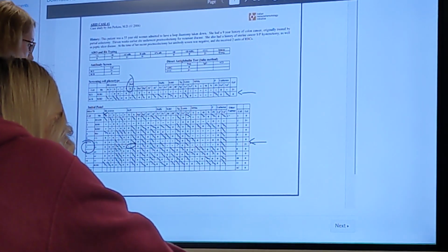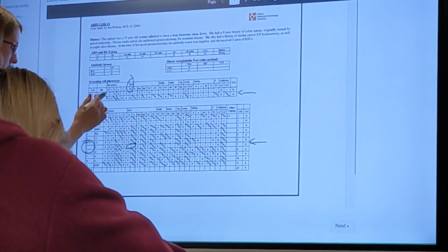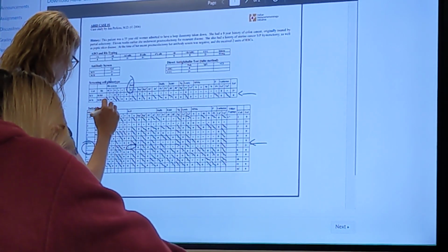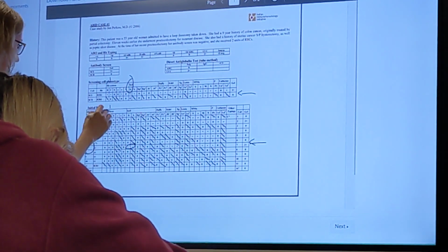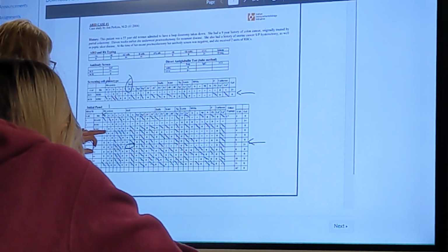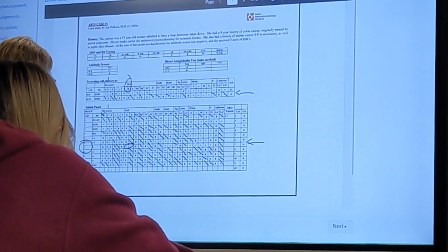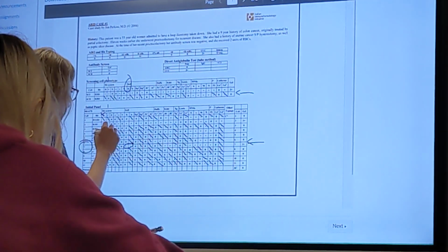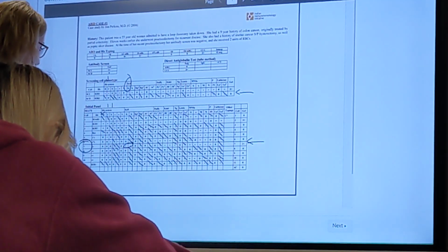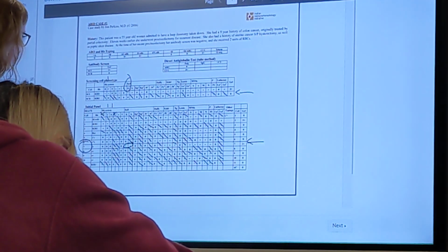So, are we ruling out D? I have 3 for D. Big C, and make sure you're using your screen also. So look at both. For C, I need one more. Big E, I only got one. Should I get another one? I got one on top and then I got one on 3. Okay, so hard to see on here. For c, I need one more. Little c, we ruled it out. Little e, ruled it out.